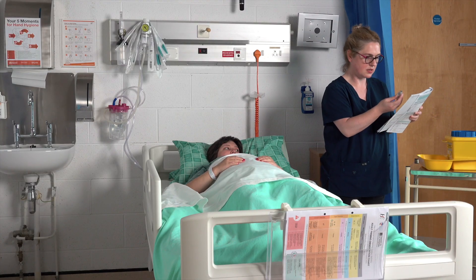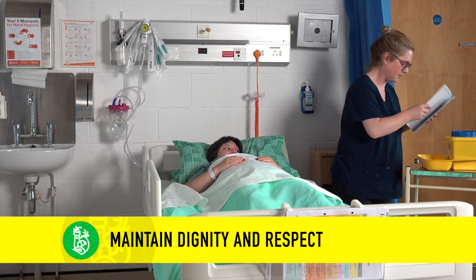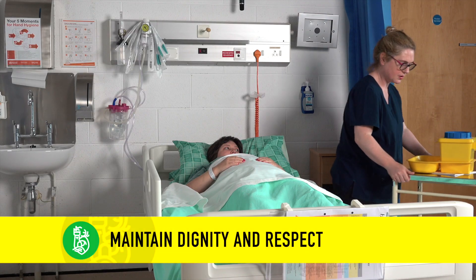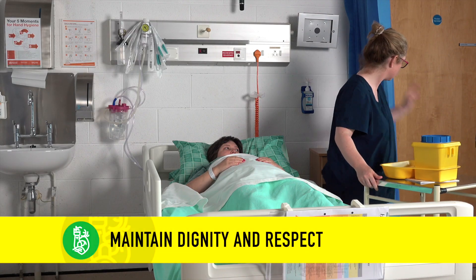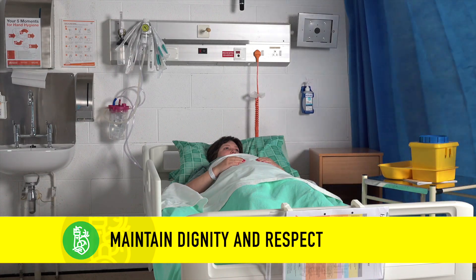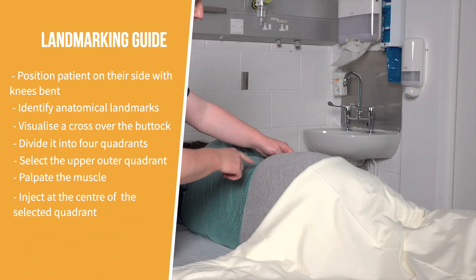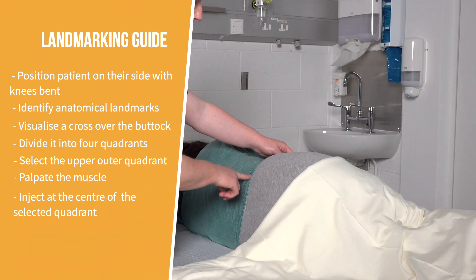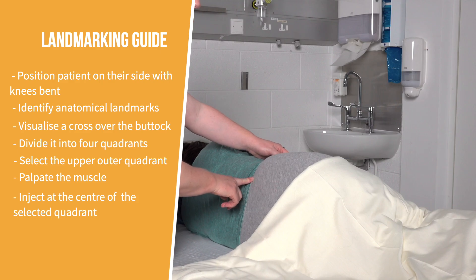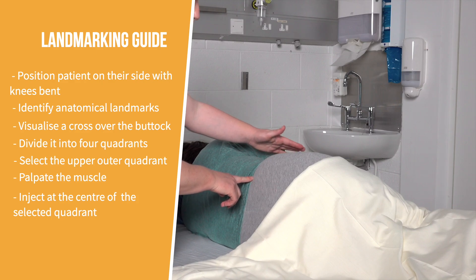Maintain the patient's dignity and respect by closing the curtains for the procedure. Ask the patient to lie on their side with their knees gently bent to relax the gluteal muscles.